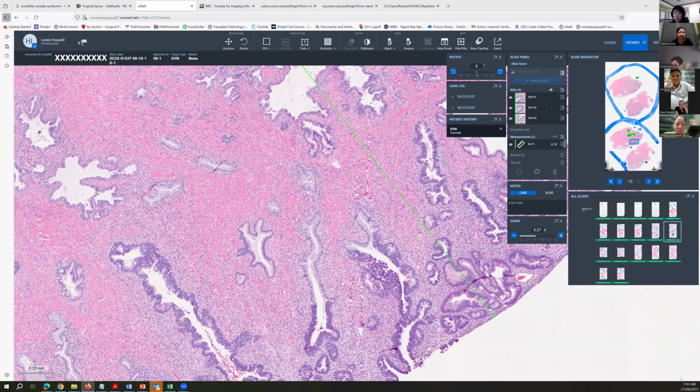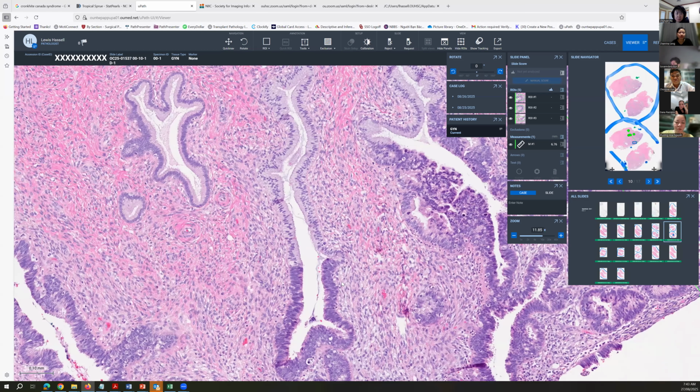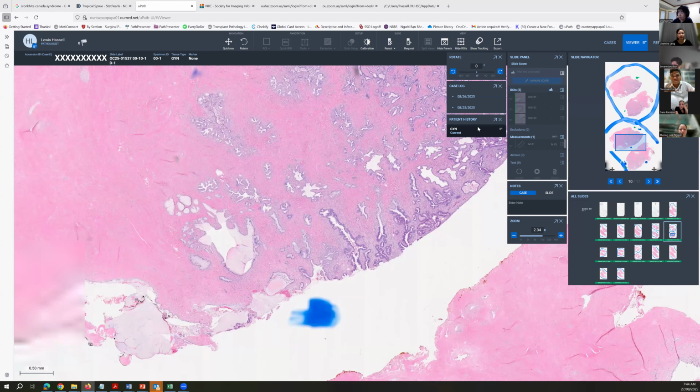juxtaposed to a more normal area of epithelium here. So another question is, could she have two things? Could she have a typical HPV-related endocervical adenocarcinoma and adenoma malignum? Well, that would be two uncommon events occurring in the same patient. So we usually don't like to do that. But there, things that are strange happen.